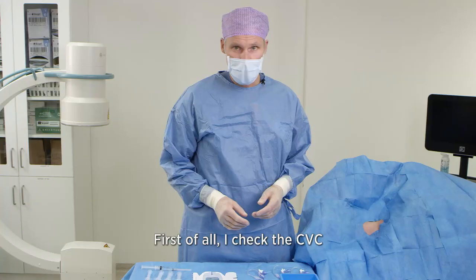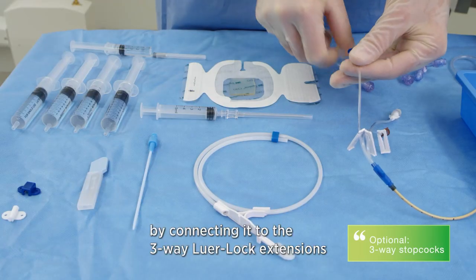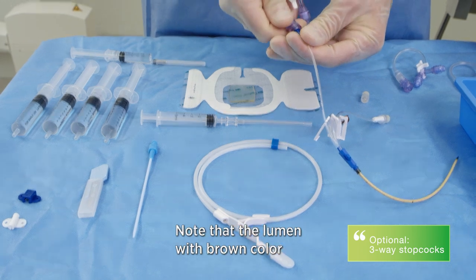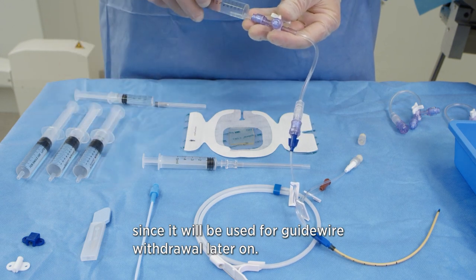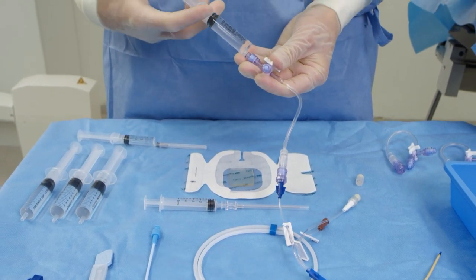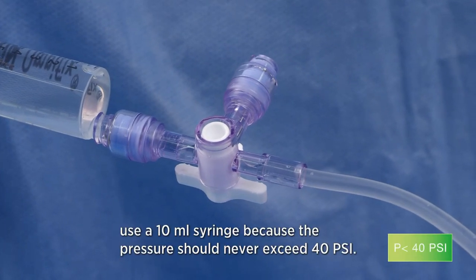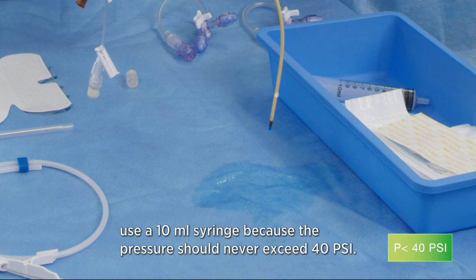First of all, I check the CVC by connecting it to a three-way luer lock extension and fill them all with normal saline. Note that the lumen with brown color should be left open at this stage since it will be used for guide wire withdrawal later on. To minimize the pressure during flushing, use the 10 milliliter syringe because the pressure should never exceed 40 PSI.